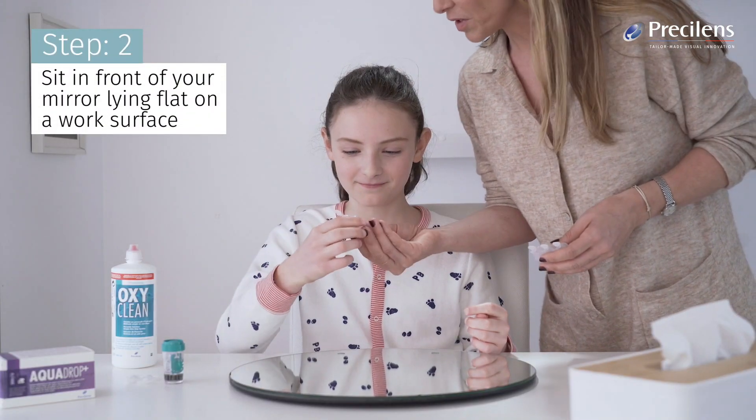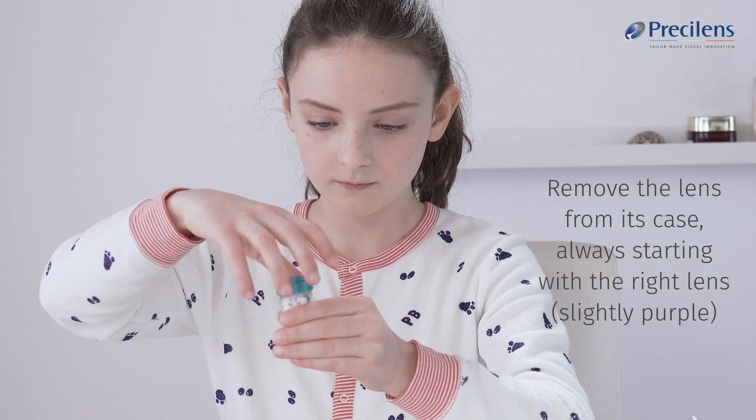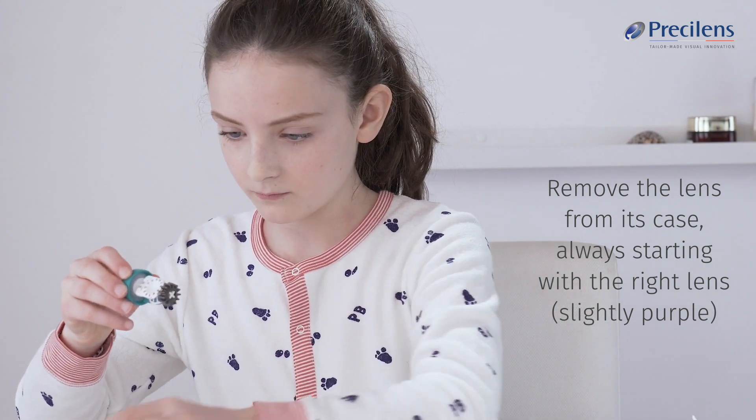Sit in front of your mirror, lying flat on a work surface. Remove the lens from its case, always starting with the right lens.